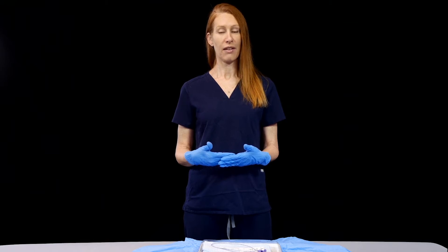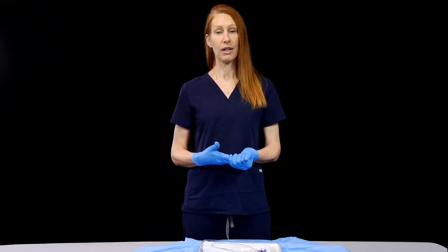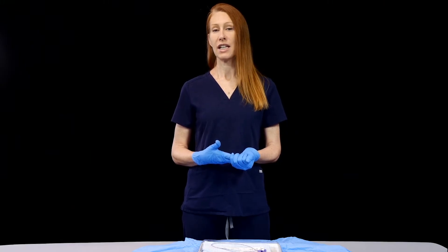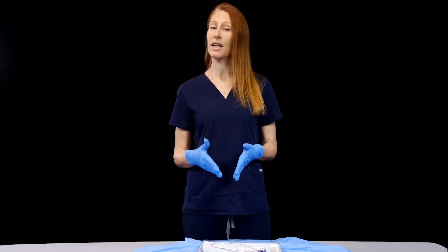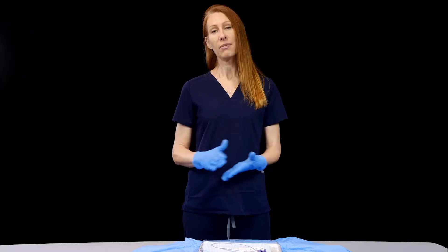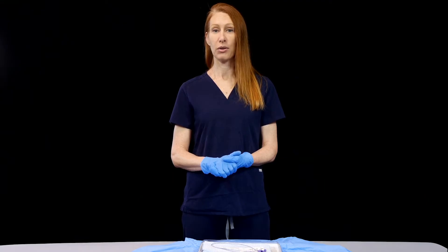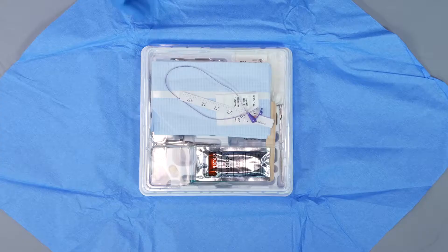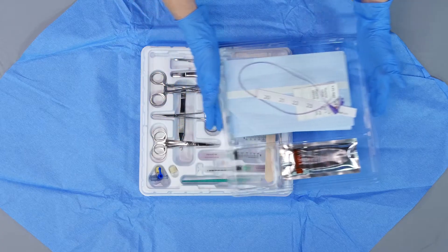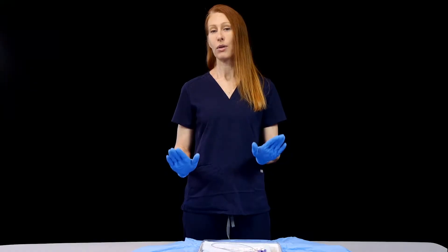Some emergency departments have their own kit for this procedure, and sometimes we have to put the supplies together on our own. But if you order a kit from the NICU upstairs, you're going to get a big deluxe kit with a whole lot of stuff that you don't need, because the umbilical lines done upstairs in the NICU are a little bit different than what we're doing on an emergency basis. So the first thing you want to do is open that kit up and get rid of most of the stuff so you only have the supplies you really need.